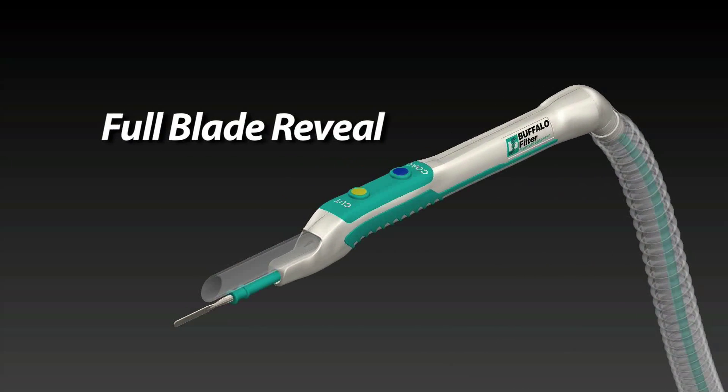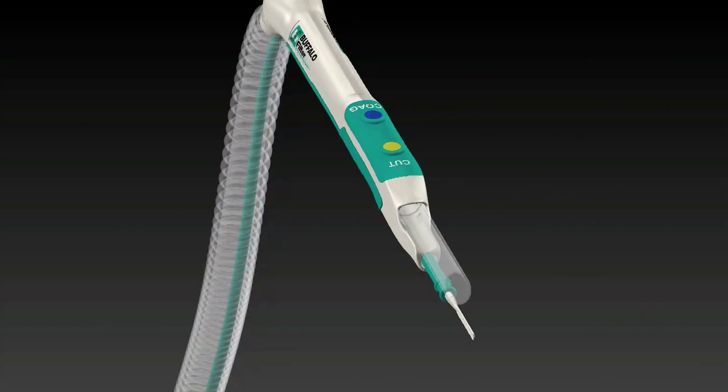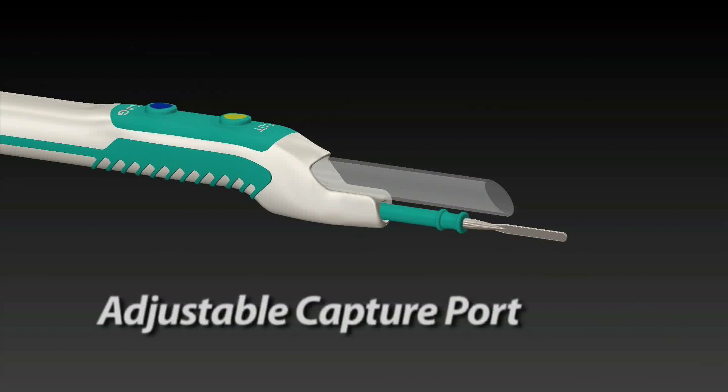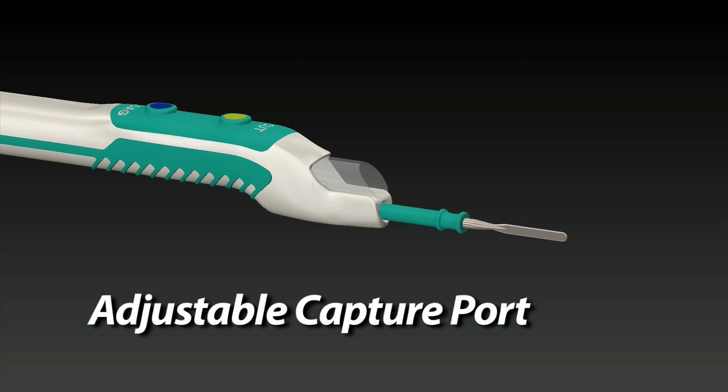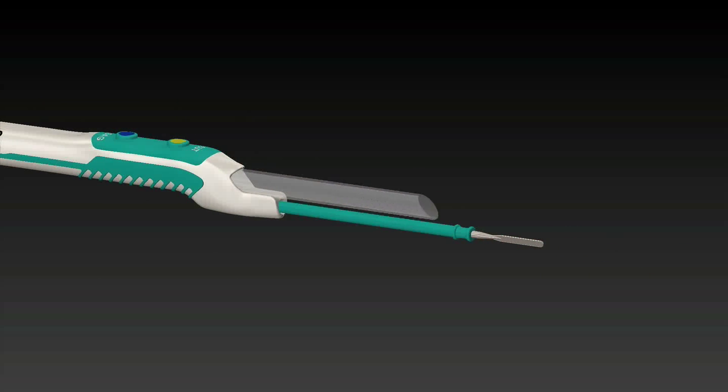With our full blade reveal design, Plume Pen Elite offers exceptional visibility for the surgeon. The adjustable capture port can be easily positioned to accommodate multiple blade lengths. By extending and retracting the port, plume capture is optimized.